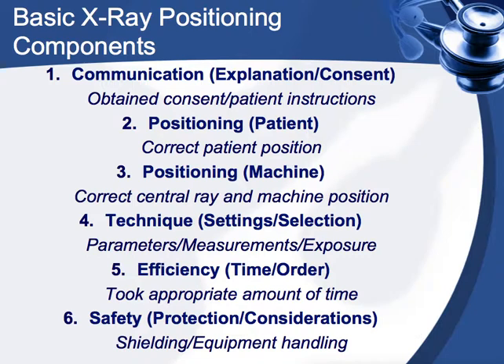Question number 5. Efficiency, time, and order. Did they take the appropriate amount of time and use a logical order? Lastly, is safety, protection, and considerations. Did they use proper shielding and proper equipment handling?